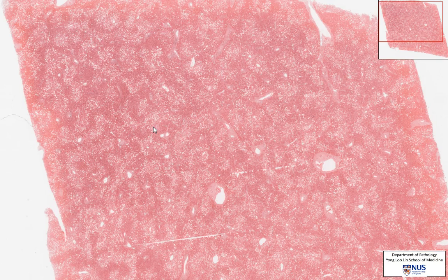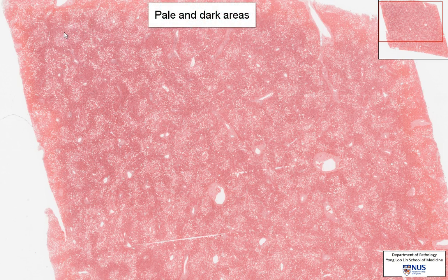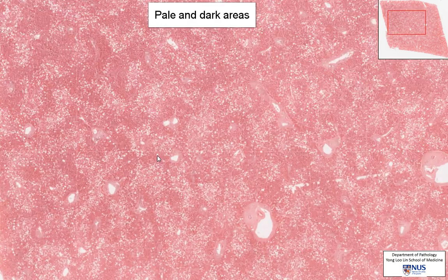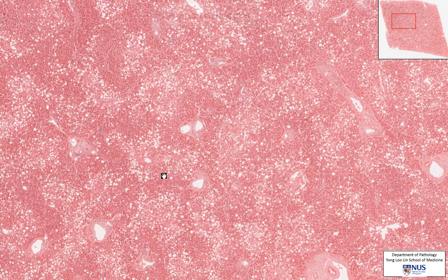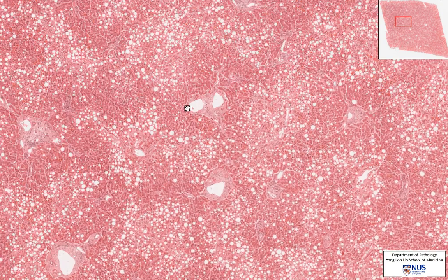This is a microscopic section of the liver and we can see that at low power magnification, there are alternating paler areas and darker pink areas. Let's zoom in to find out what's going on.